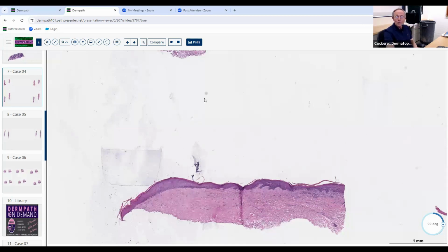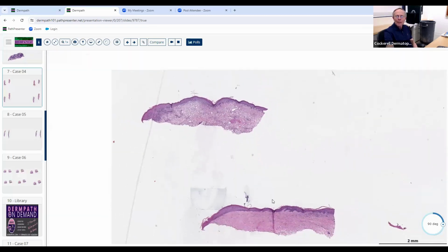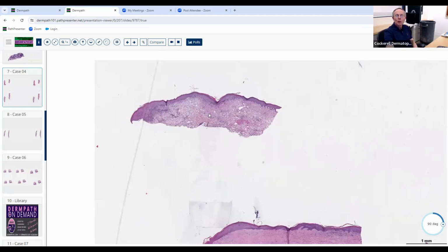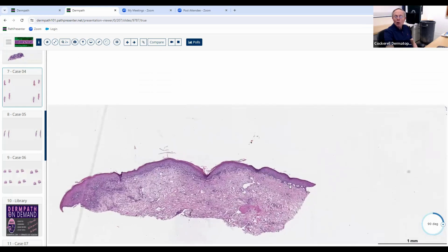So where can you see this pattern? Well, some cases of lupus can give you dermal sclerosis. So that would be one thing in the differential diagnosis. But another situation that would be more likely is something like chronic graft versus host disease, because that can give you both of these patterns. The relatively acute form gives you a vacuolar interface dermatitis like this, with the individual necrotic keratinocytes, looks very much like possibly evolving erythema multiforme, or it can look like lupus, look like a vacuolar interface drug eruption.